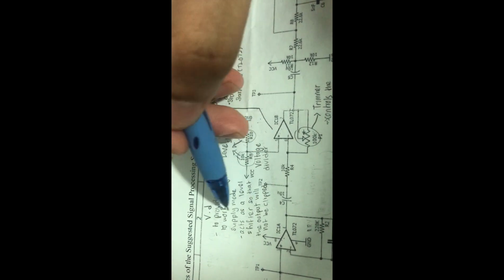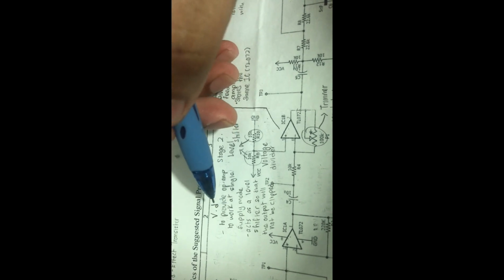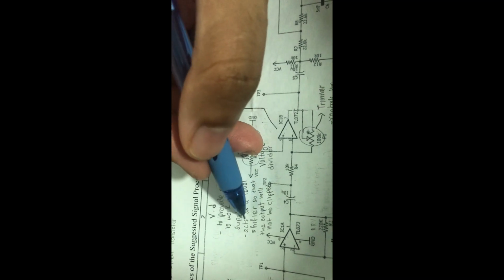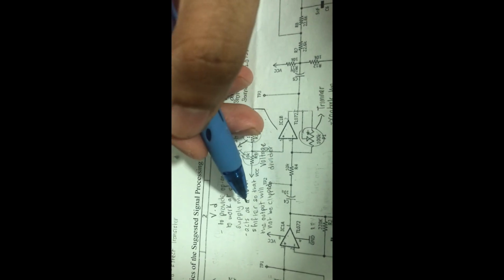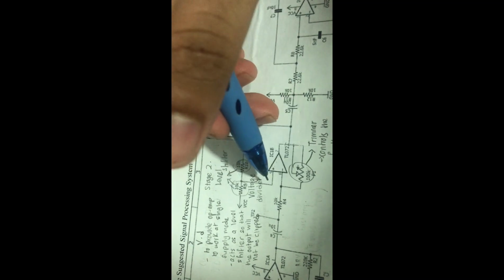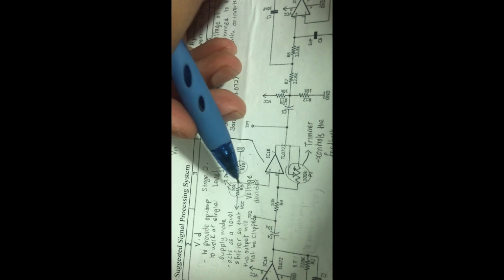Okay, so this voltage divider circuit is quite a special circuit because it has two functions here. It enables the op-amp to work in single supply mode, and also it acts as a level shifter so that the output will not be clipped. So this is a level shifter. At the same time, it enables this part of the circuit, the whole circuit, to work in single supply mode. So that is all basically for stage 2.